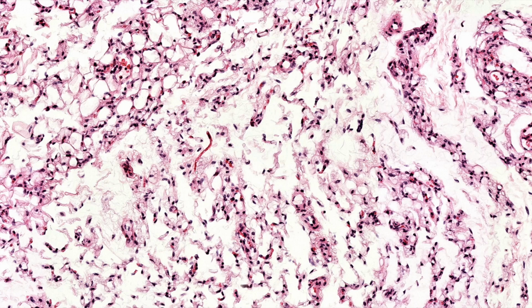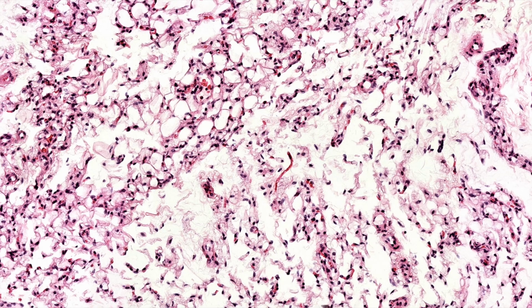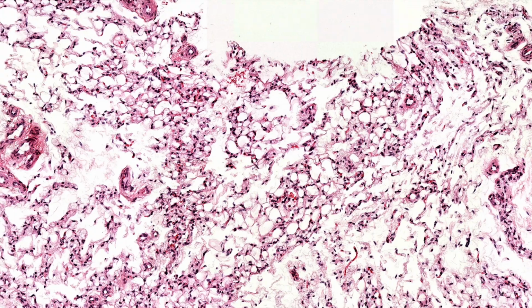So as the fat cells shrink, more and more of the vessels get closer together and you can see more of them. So fat always has this amount of vascularity and cellularity. It's just way more, or I guess let me say, these cells are always there in fat. They're just all closer together when there's not all that big white space pushing them apart. So that's what results in this unusual appearance.